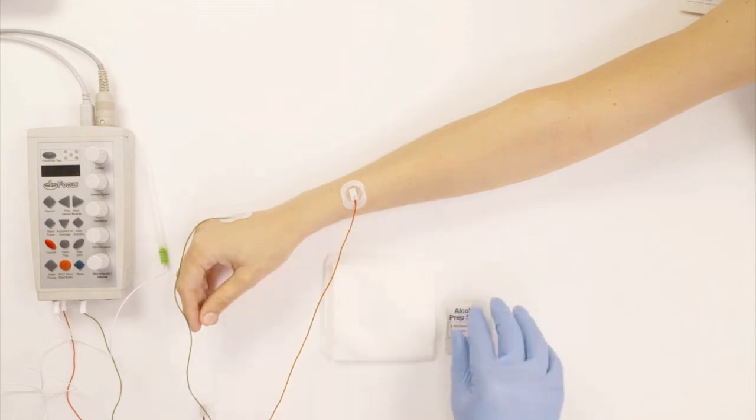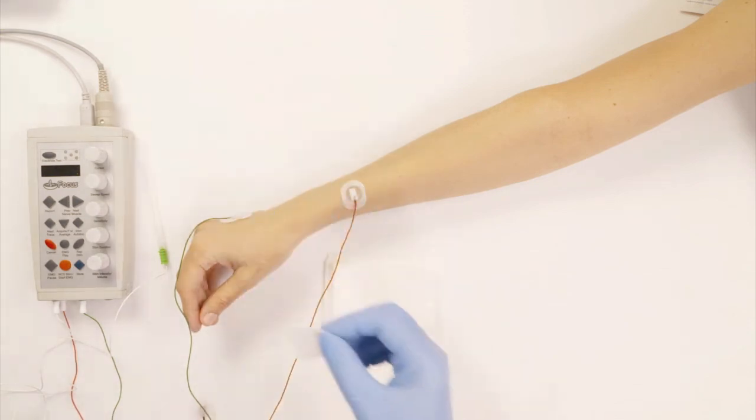And of course, we have an alcohol swab to wipe the muscle or the skin area of the muscle before you get started. So these things are always on my side here.